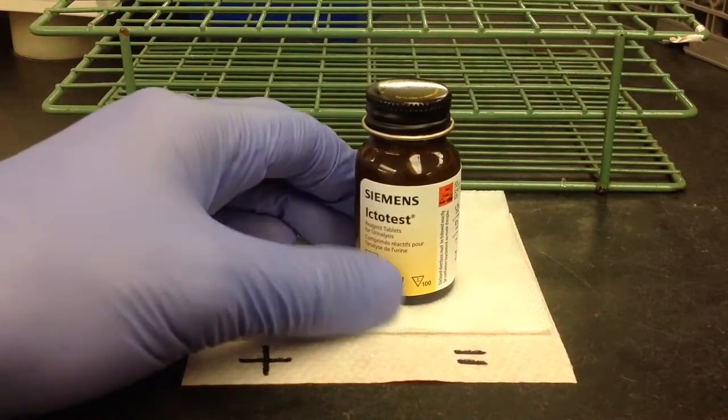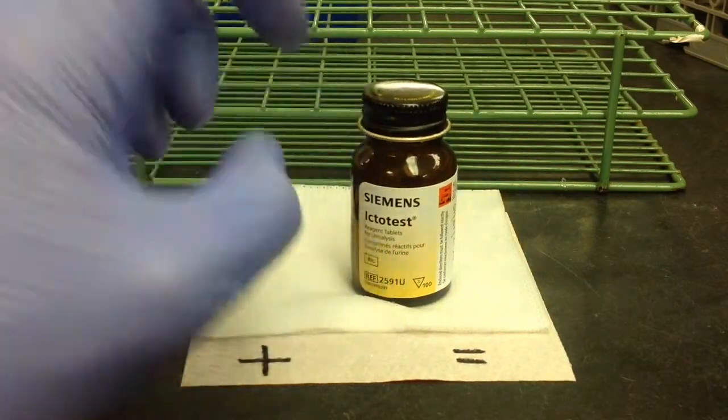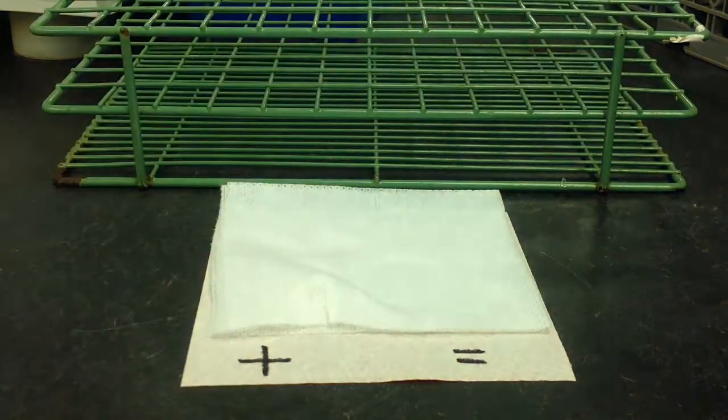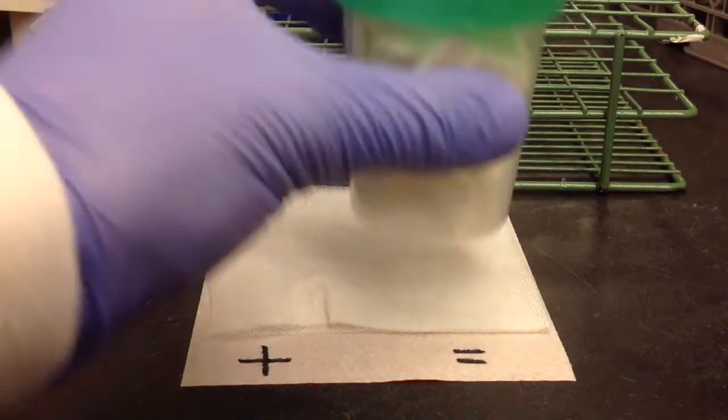In this video, I'm going to show you how to perform the Ictotest on urine, and this is typically used as a bilirubin confirmation test.